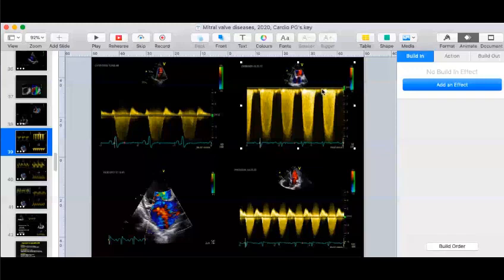And also when you look at MR, you should also say whether it is a holosystolic MR or whether it is late systolic or mid to late systolic MR. Where do you get mid to late systolic MR?